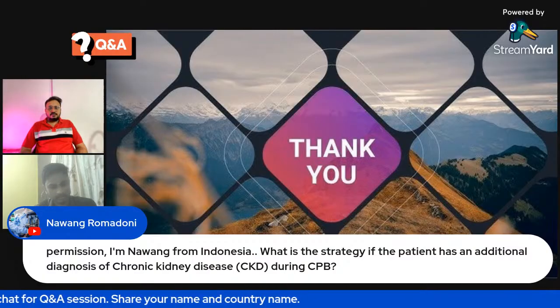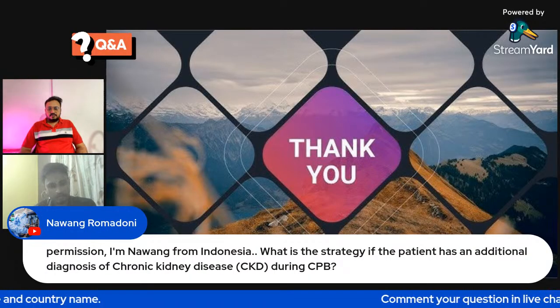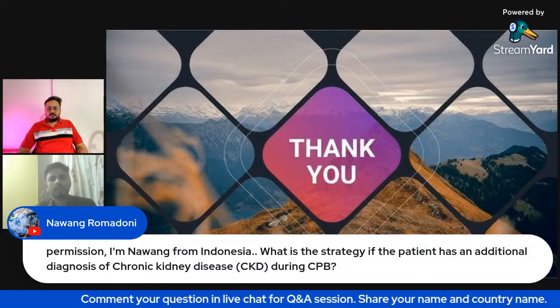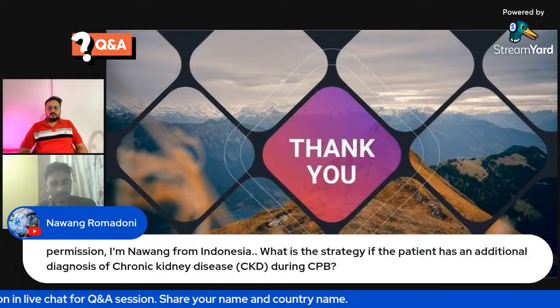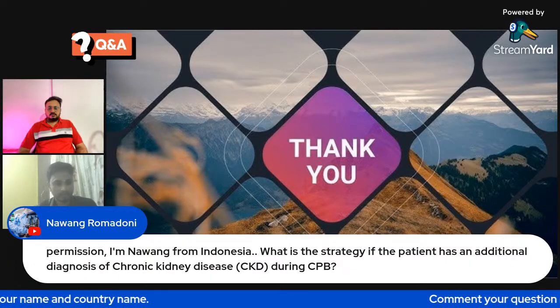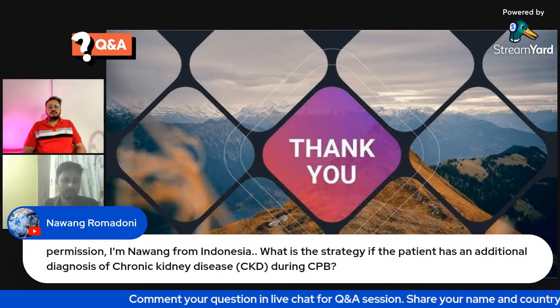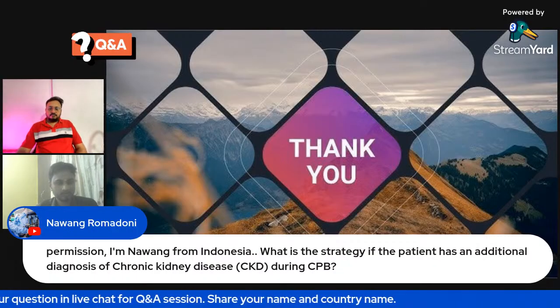For a chronic kidney disease patient, we will definitely use ultrafiltration techniques. And one more thing, we need to watch the potassium and electrolyte balance. MUF is beneficial for this patient because after CPB, instead of diluted blood going, we send it through filtration. That is the benefit.